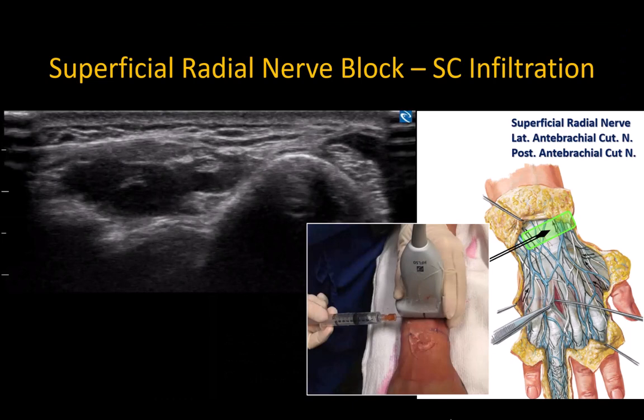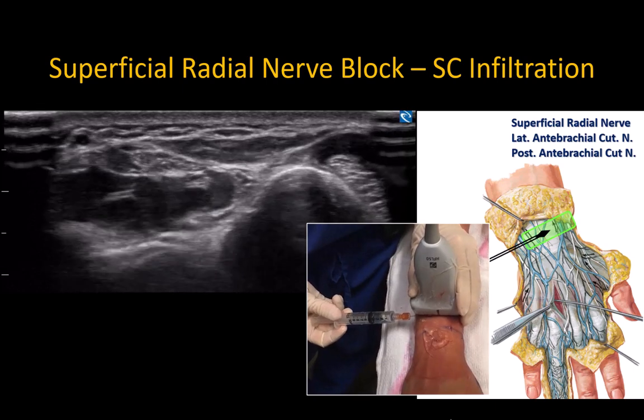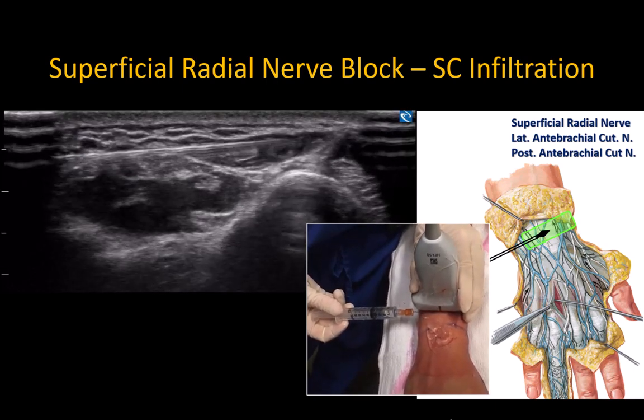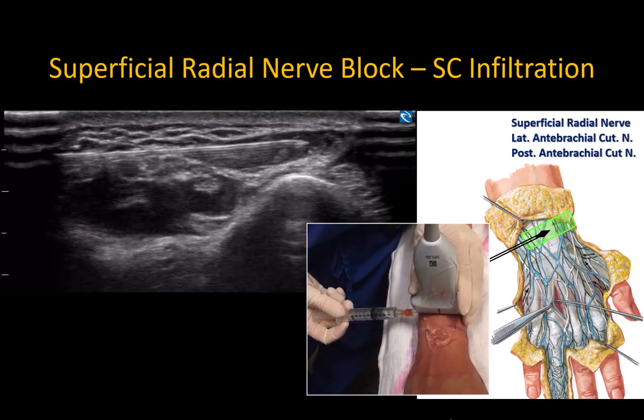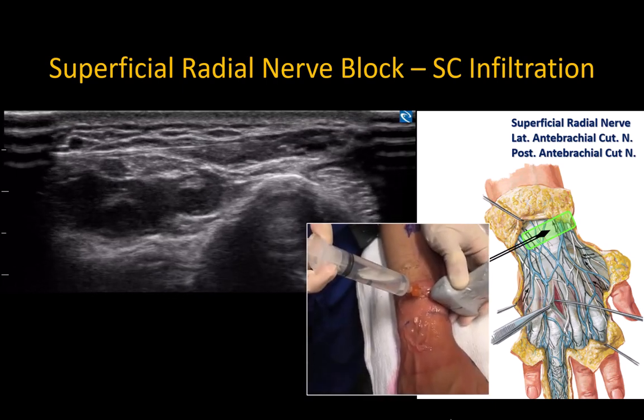If you have trouble finding the nerves, a simple alternative is subcutaneous infiltration over the lateral wrist just proximal to the anatomical snuffbox. Extending the injection more medially over the posterior aspect of the wrist will also block the terminal branches of the posterior and medial antebrachial cutaneous nerves. Performing the injection under ultrasound guidance helps ensure injection in the correct subcutaneous plane above the investing fascia of the wrist and under the dermis of the skin.